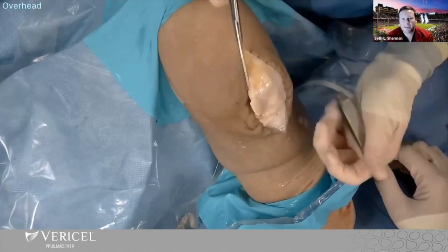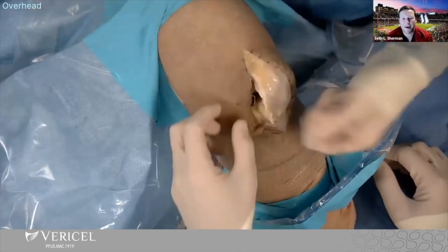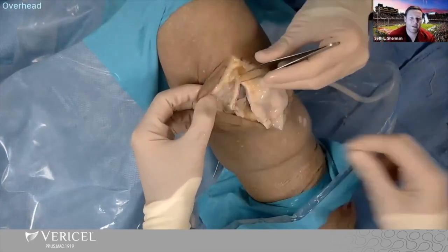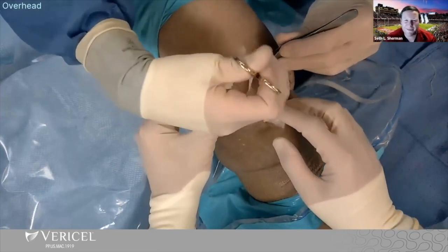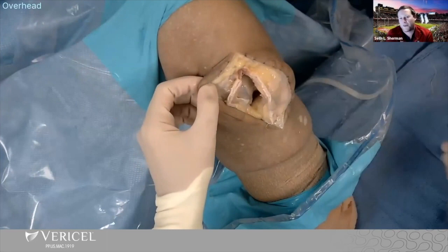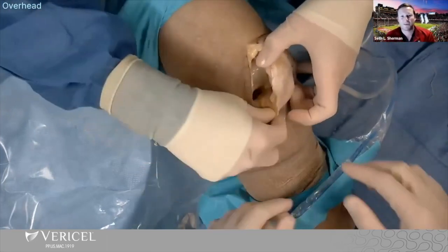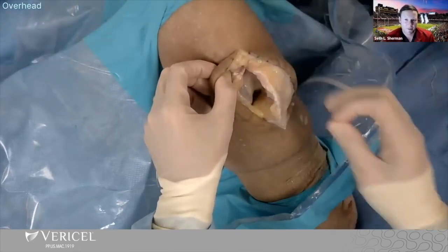For me, on those trochleas — especially in those 30 or 40 year olds, isolated trochleas without malalignment — I might go to an osteochondral solution without an osteotomy. Whereas if I'm doing a cell-based repair in the PF joint, I'm typically adding even an anteriorization. It's just dealer's choice where you get great outcomes in your own hands. If I can get away with an isolated MACI and get awesome outcomes most of the time, that's obviously much easier than adding a concomitant procedure.